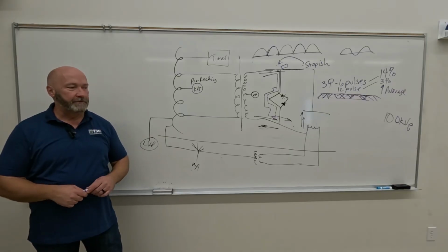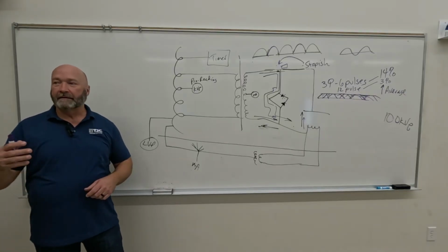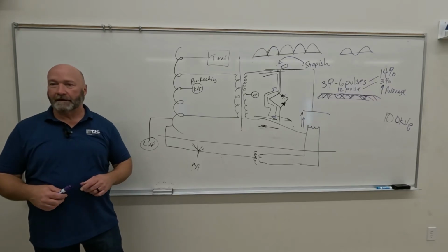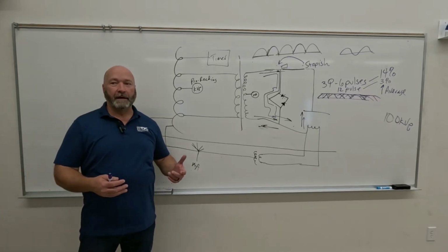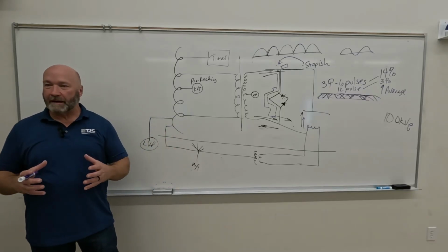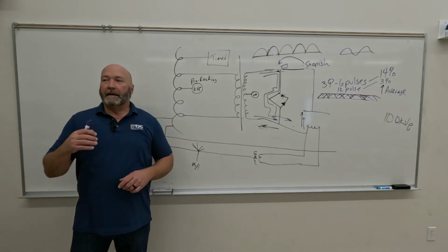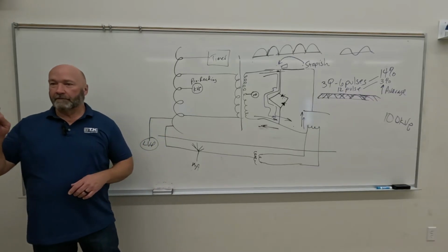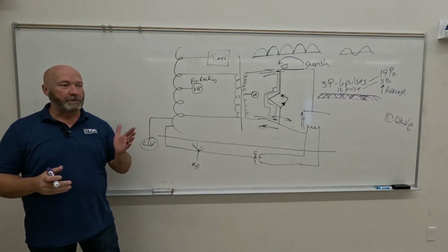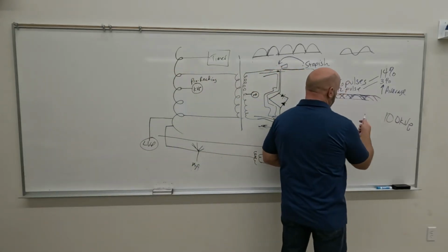A capacitor discharge portable unit might be one where you plug it in, and think of capacitor discharge as being kind of like a single shot battery, okay? So a battery is a thing that stores electrons. And a capacitor discharge is kind of the same thing, only it stores energy for a single use, right?